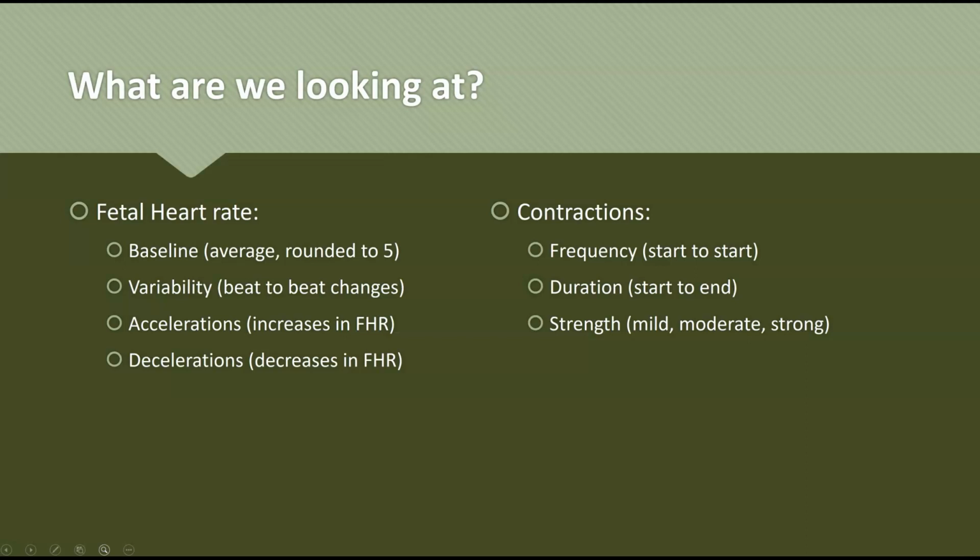Now, if you can think of putting your hands on a pregnant woman's abdomen to palpate the strength of a contraction, if you take your finger and push on the end of your nose, the tip of your nose. We have some firmness, but it's still squishy, right? You can feel. That would be resembling a mild contraction strength of the abdomen.